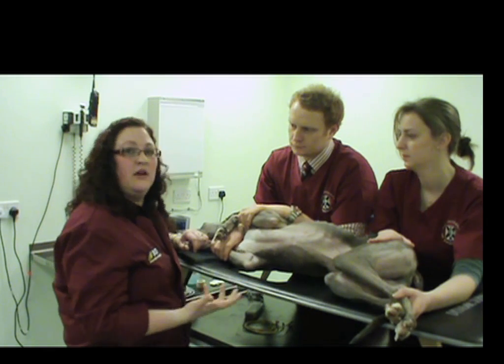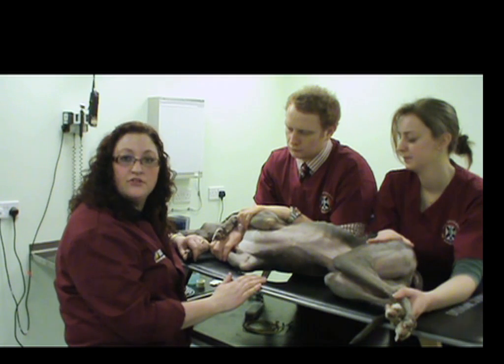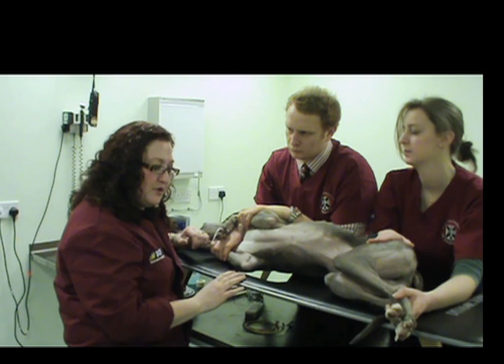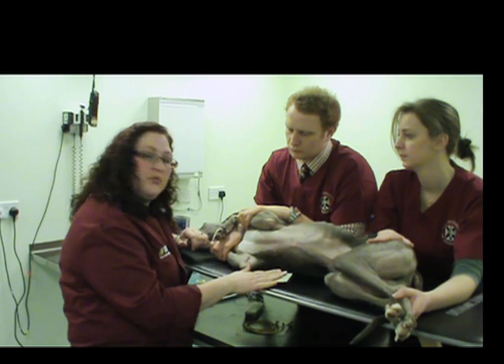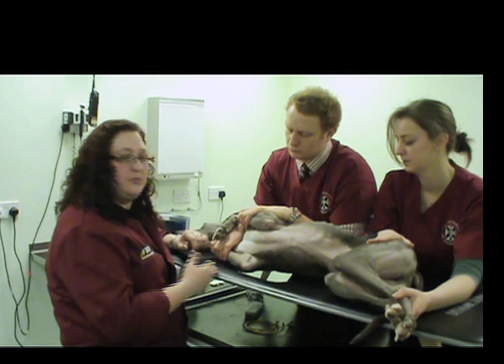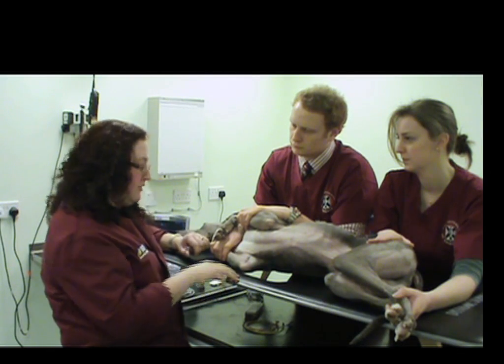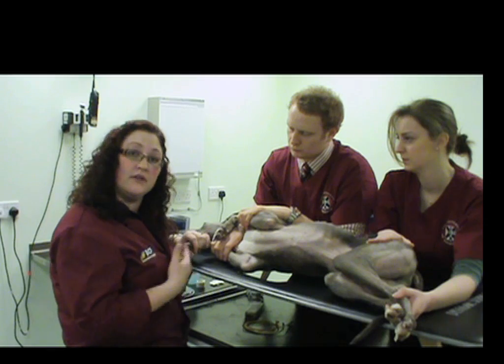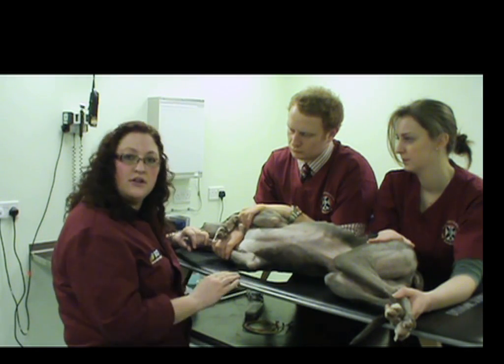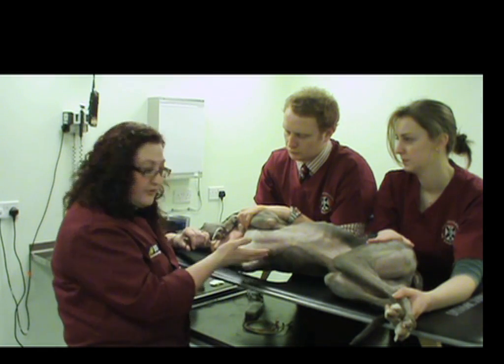Another thing to consider is the machine that we have available. There's a wide range of ultrasound machines in general practices — some will be cart-based, large ones that wheel around the room, and some that are quite portable. The most important thing is that you feel comfortable with using your machine. There are dedicated machines with specialist probes, specialist cardiac measurement packages, and specialist features for more advanced cardiology, but that's outside the scope of these videos. The main thing you need is an ultrasound machine and a probe that will be able to gain an image.